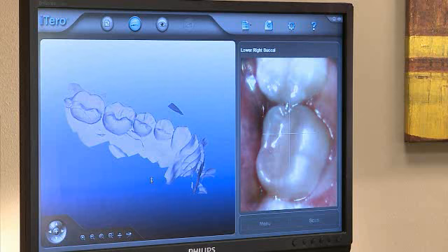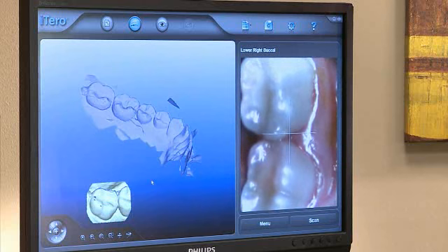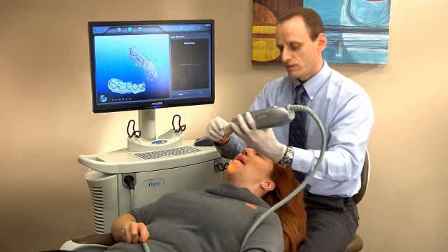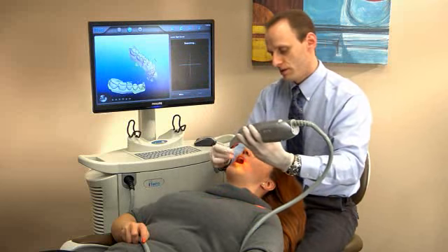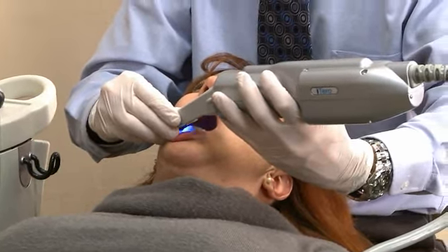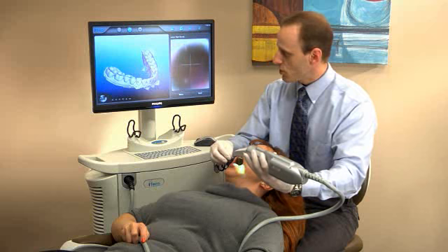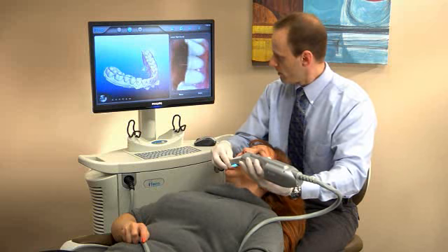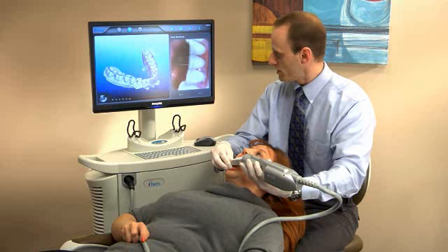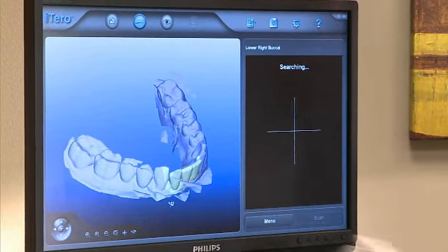Mike repeats the process on the right side of the lower jaw, beginning with the most distal tooth and moving forward to the midline, paying special attention to capture the interproximals. Now as you get towards the midline on the right-hand side, as a right-handed person, it might be more comfortable to switch to my left hand. And see the two arches come together. I'm going to take one additional scan at the midline just to fill in a small hole I see. Mike completes his lower arch scans by taking the lingual scans of the right side.